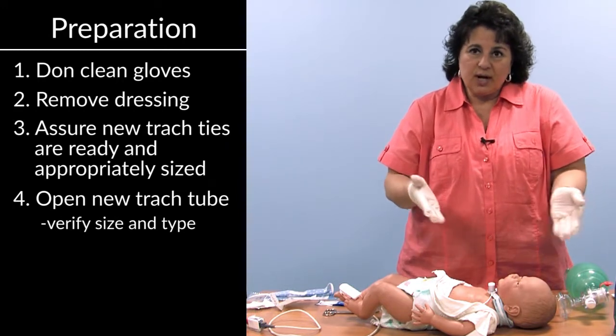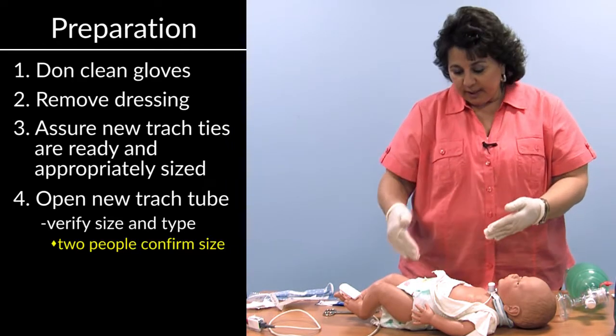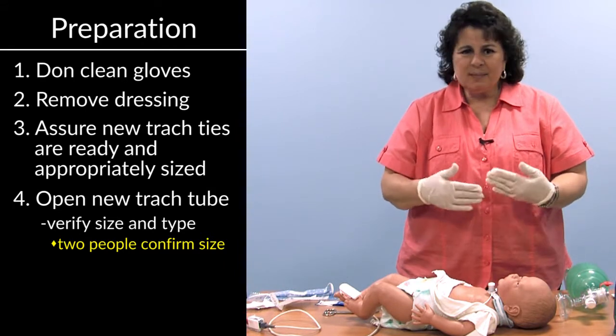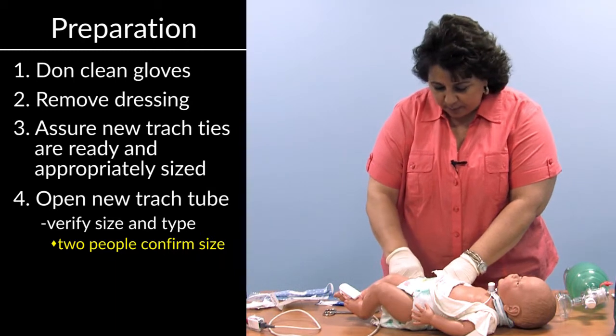Obviously, this is your child, and you're quite sure of that. But please do have two people look at the tracheostomy tube and assure that it is the right size that you're placing in. Sometimes you get a lot of deliveries, you have a lot of equipment, and things can get mixed up a little bit.